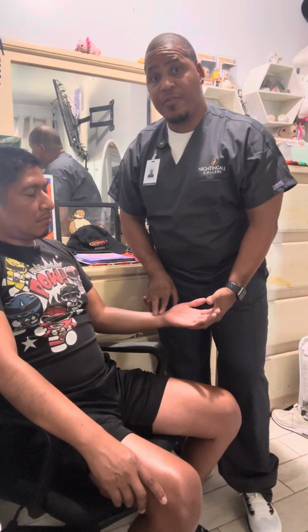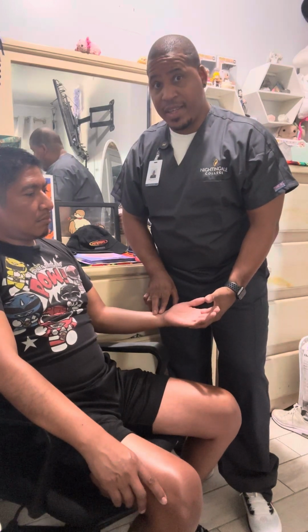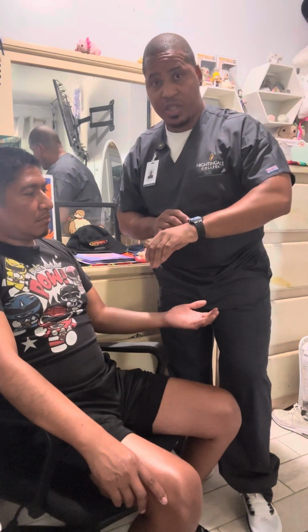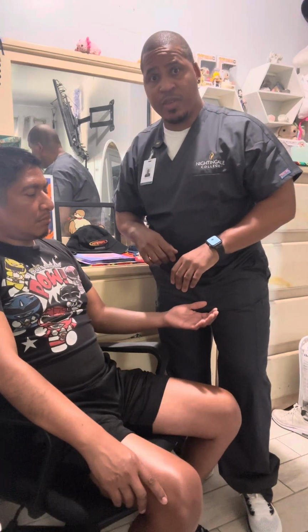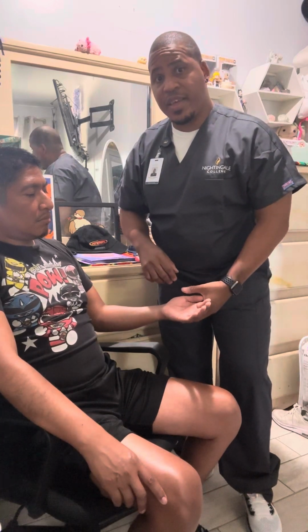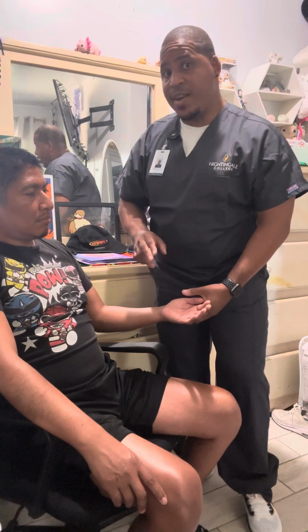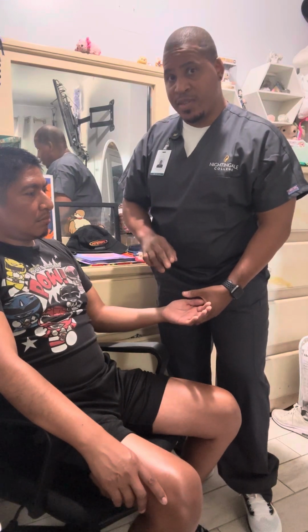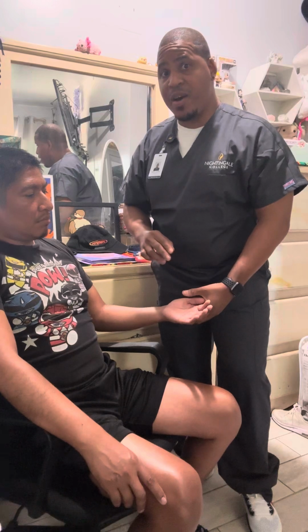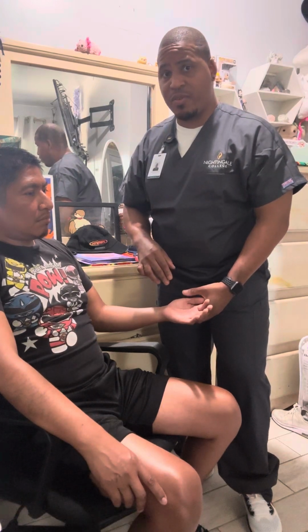I will count that for 30 seconds and times it by 2. And I have my second-hand watch that I can count the seconds.